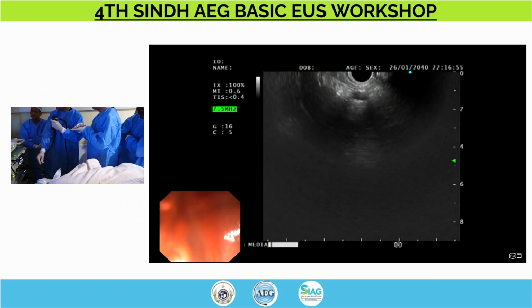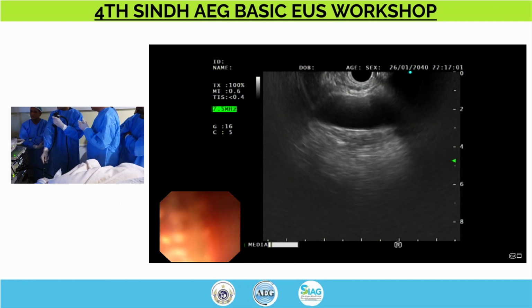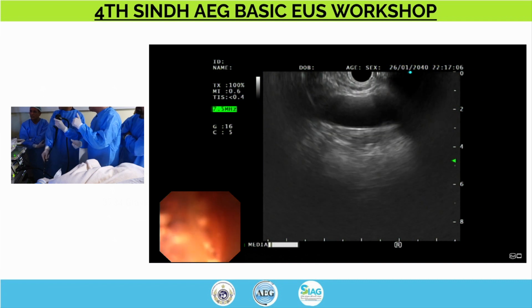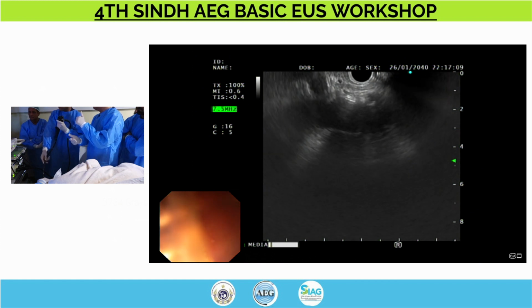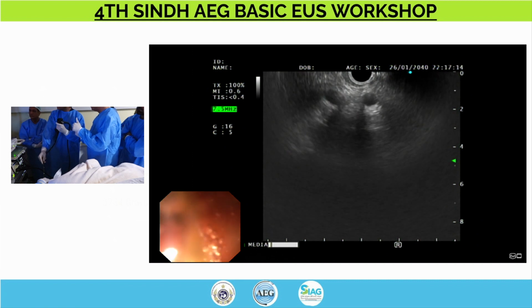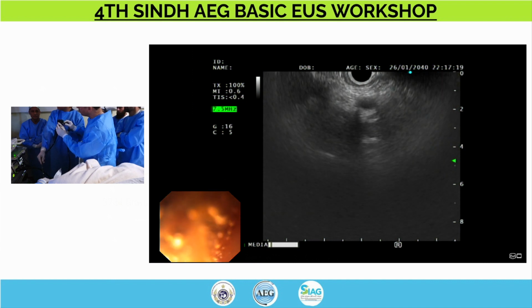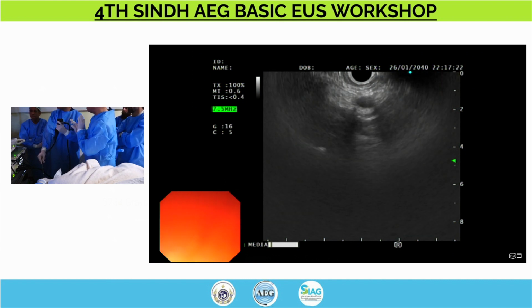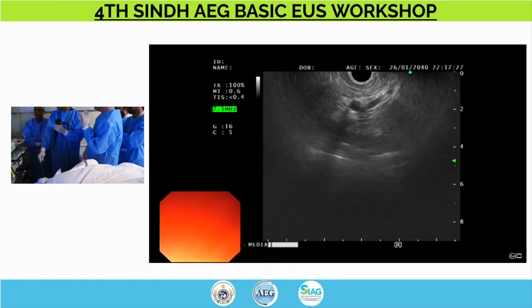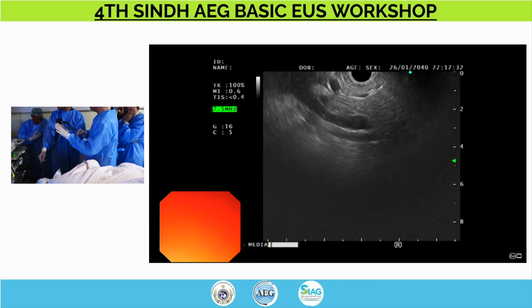Sir, forward? No, look, from the aorta you have to go to the celiac artery. When you go to the celiac artery, big wheel slightly away from you and a slight gentle push further. So where is the celiac artery? Here, ahead, the celiac artery, big wheel slightly away from you. Also make a habit that you need to stay away from the air. Air is something which is not required in the US. So never ever insufflate air. Have the air button switched off.